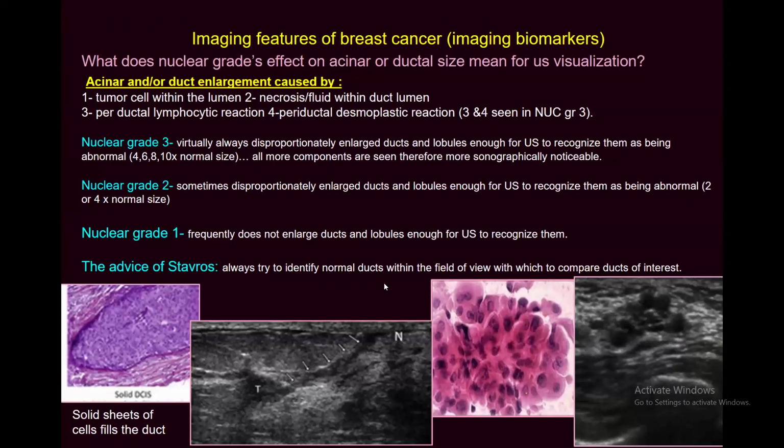Again, the imaging features of cancer, or imaging biomarker. According to Stavros, what do nuclear grade effects on acinar or ductal size mean for ultrasound visualization? He said that there are, definitely, you can explain it more than me, Dr. Nadia, this part.